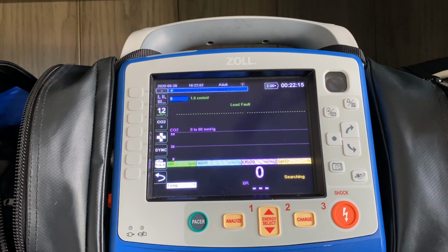So the same idea applies here. You're going to use your oral nasal cannula, and based on what protocol you're following, you're going to ask yourself, is this patient hot or are they cold? Because they can be warm or cold septic. What's their heart rate? What's their respiratory rate? And what's their end tidal CO2 value? So all of those will play into you making a decision as a clinician on whether or not you need to call a sepsis alert.